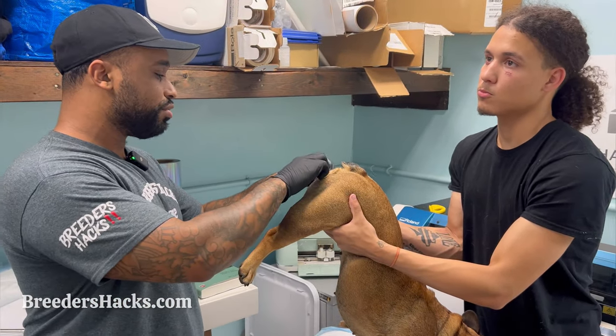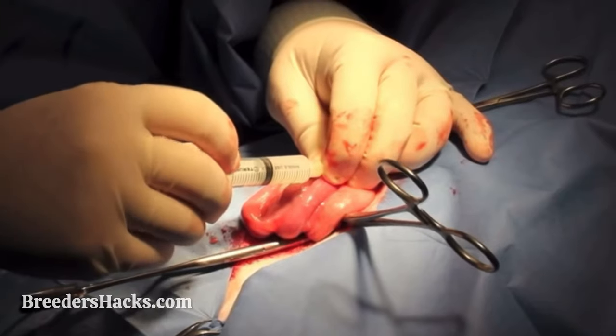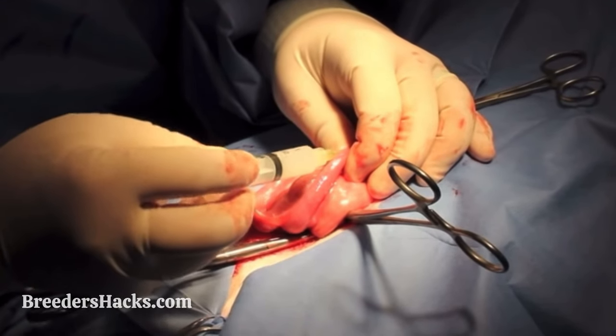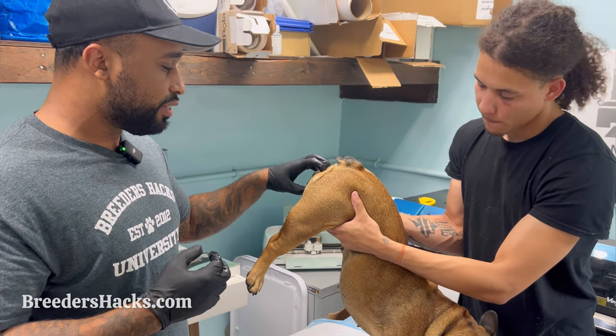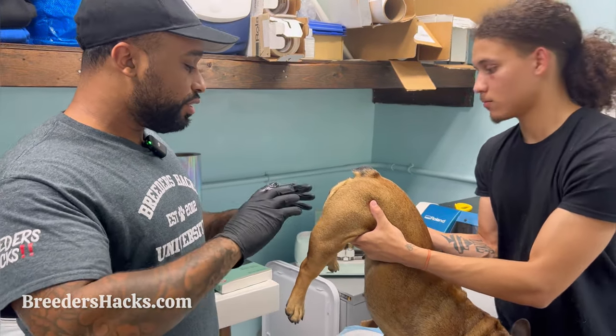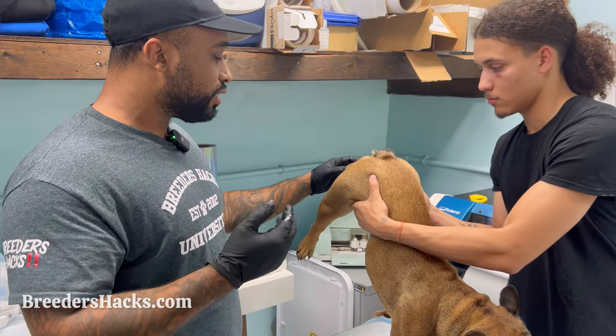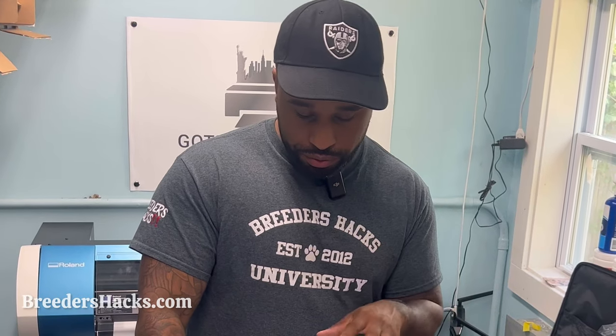This is essentially similar to a surgical — they're putting it in the uterine horns, which is slightly further up, but in my opinion not by a whole lot. And this is less invasive — you're not putting the dog to sleep, no anesthesia, none of that. You also get a visual to make sure the female is healthy and check for any abnormalities. Just like last time, I saw a little bit of blood and was able to check right away. My vet always does a visual, looks inside the uterus to make sure everything looks sound — and you can do that same check as you're doing your TCI.